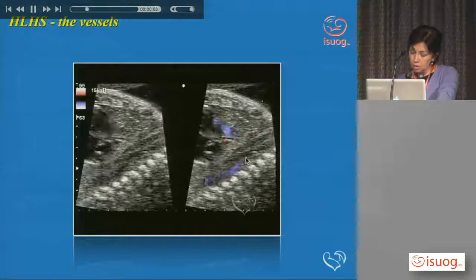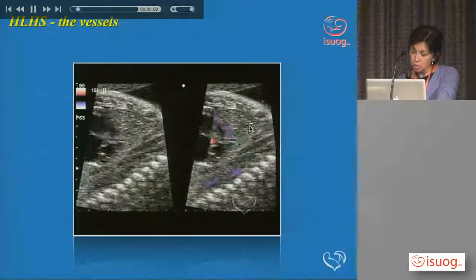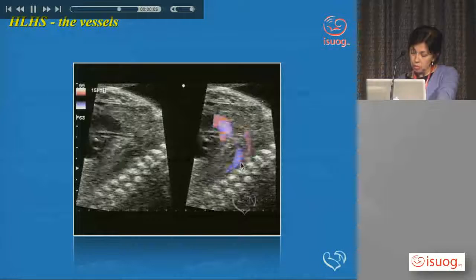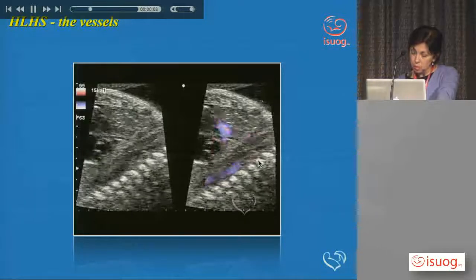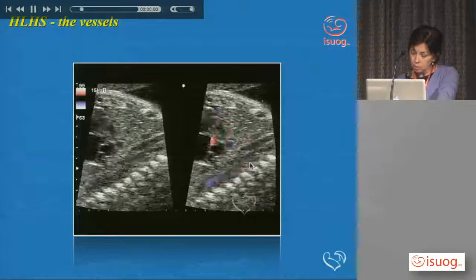There is your area of coarctation associated with the hypoplastic left heart, and you can see that shelf we're using. This one is called E-flow, which is a high definition flow. You can see that on power Doppler as well, and sometimes on the usual normal color flow mapping as well.